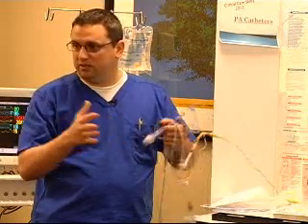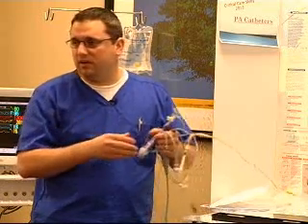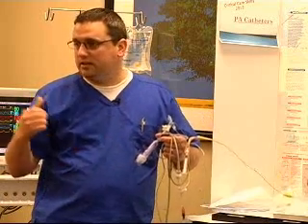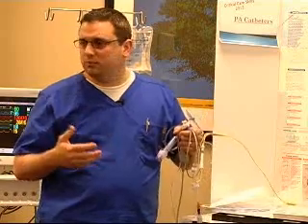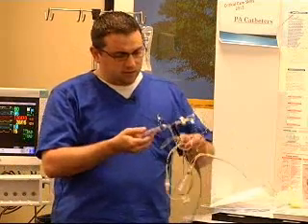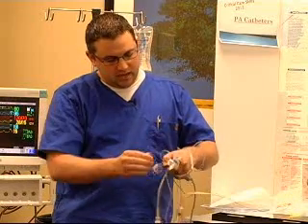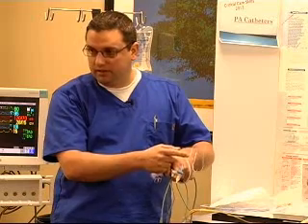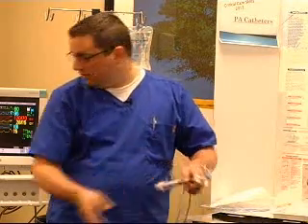So if you have a really hypothermic patient and your room is really cold, you might actually get close, maybe too close, if you're really in that hypothermic phase. It doesn't happen very often, but if you start getting an error and it tells you on the monitor that you're not within range, then you know that that's probably what it is. Okay, so we get ready to do our output. We're going to turn the stopcock valve off to the pressure line right here and open to the patient. So think about a track and how that fluid is going to travel.